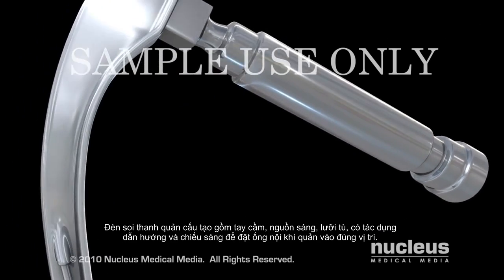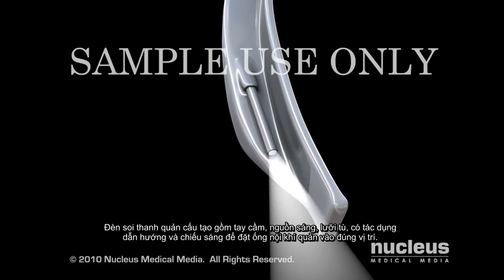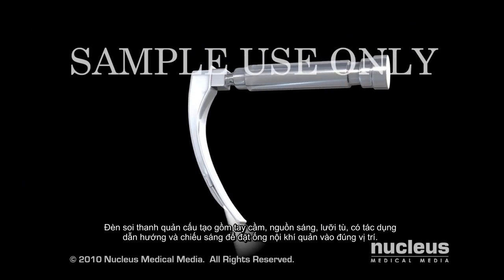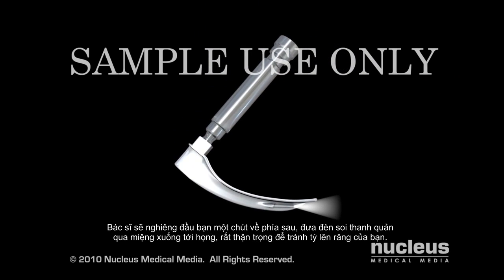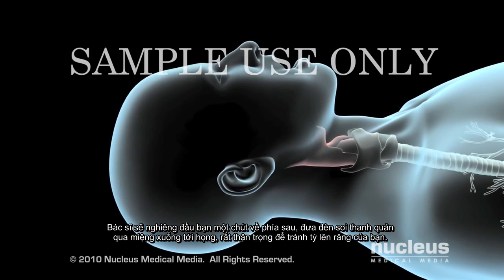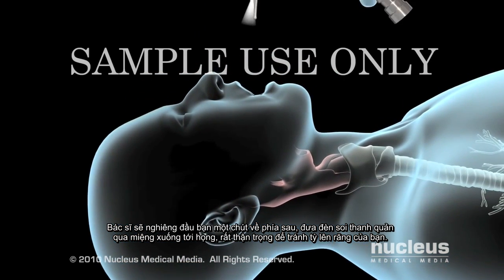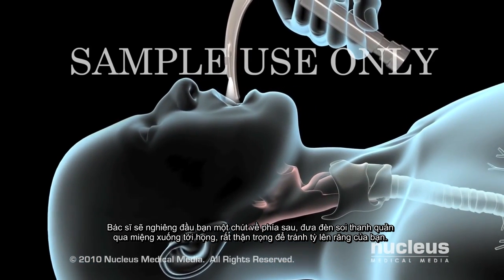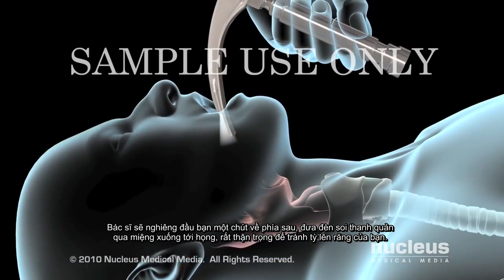A laryngoscope, which consists of a handle, light, and dull blade, helps guide the endotracheal tube to its proper position. Your doctor will tilt your head back slightly and insert the laryngoscope through your mouth and down into your throat, taking special care to avoid contact with your teeth.